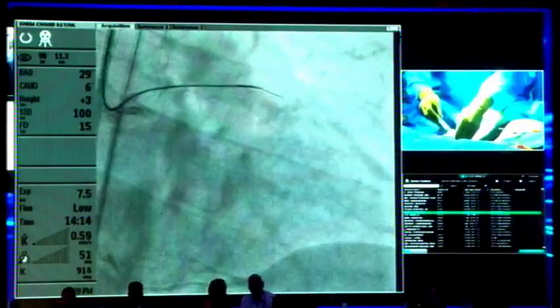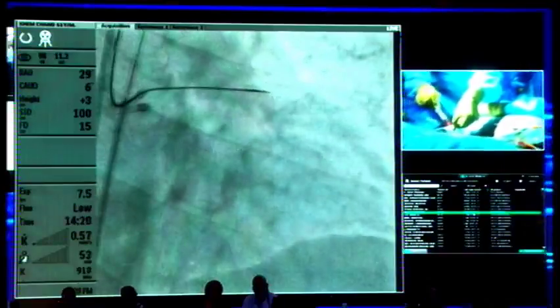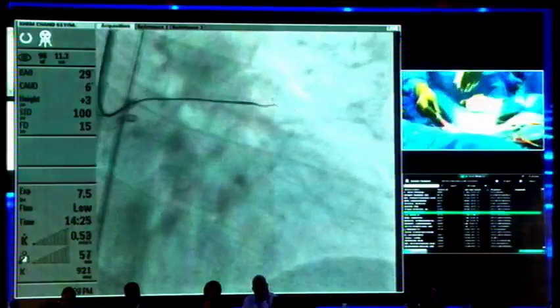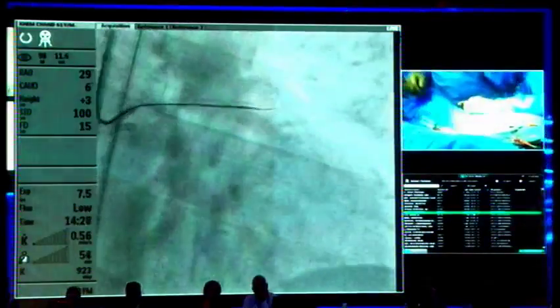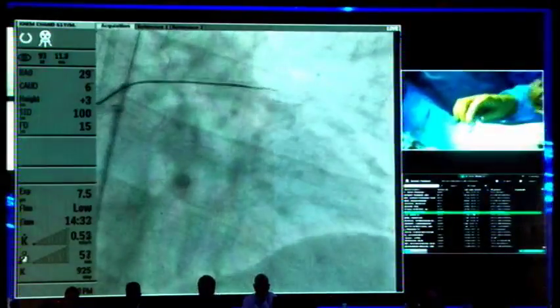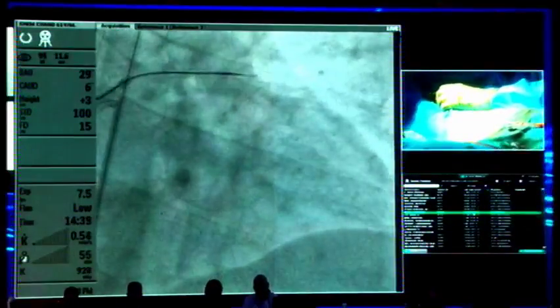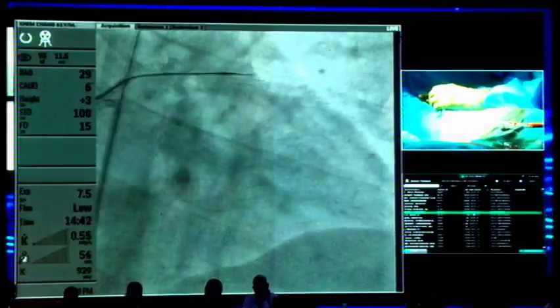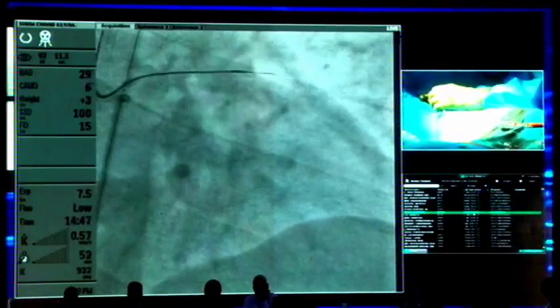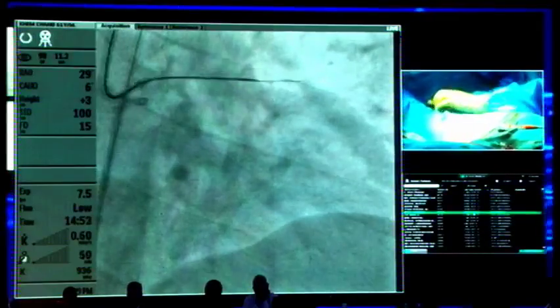Are we doing this together or not? Yeah, we are down. Slightly, but that up is a little bit here. But this is bending here, not straighter, or I'm wrapping around. So that is subintimal here already. One good shot to see what... just a second. This whole end is very much soft, delicate, and a little bit complicated here. Okay, good injection. Yep, thanks.